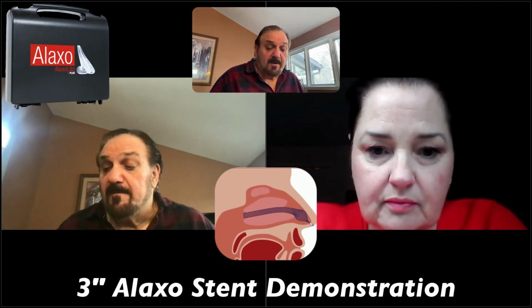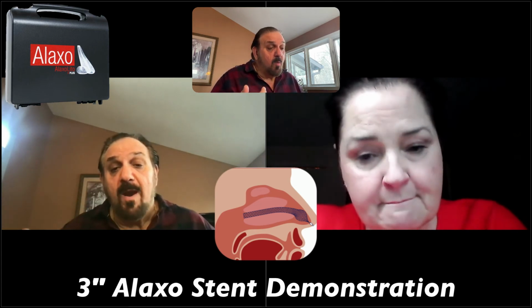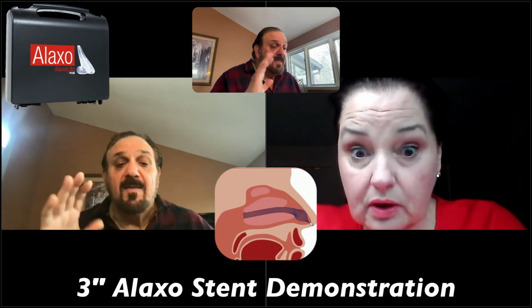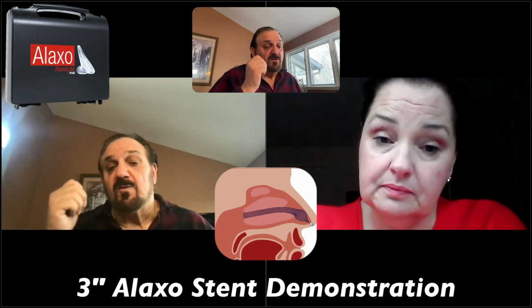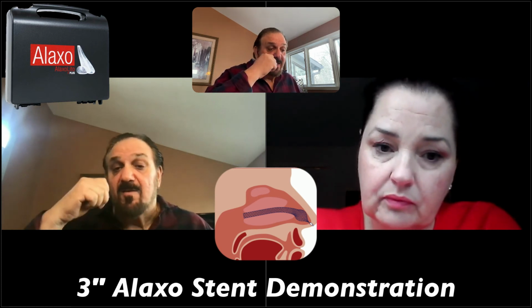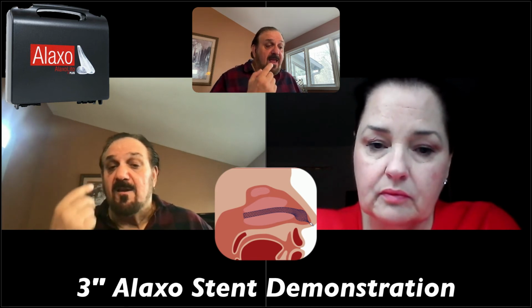So the hardest part was that initial sensation when you're going in there worried that, oh, there's resistance here, I'm going to damage something. That's probably the hardest part. But once you have the confidence that it's going to go, you just have to find the right angle and the right spot, and you slowly go at it. And I got it in twice, right? Because I pulled it out the wrong way. You did. And then I went in a second time, so I know I can get it in, no problem.